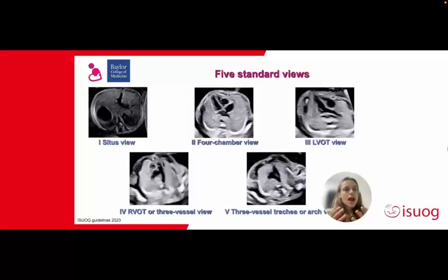So when all these AI tools started, and we were just freezing the image and automatically acquiring biometry and so on, I was always saying, but if we stop the image and the software already recognizes what we are seeing and is able to measure, why not measure live?